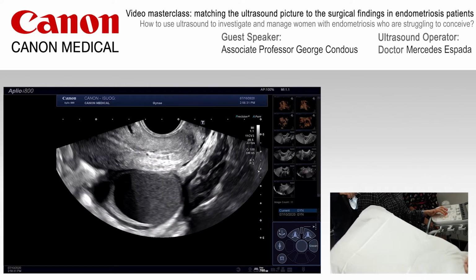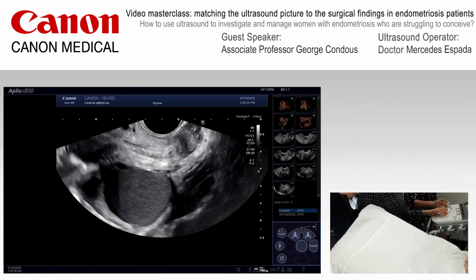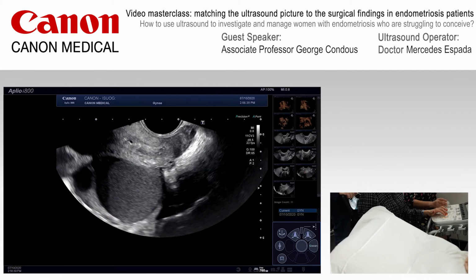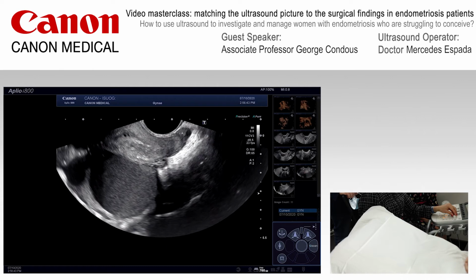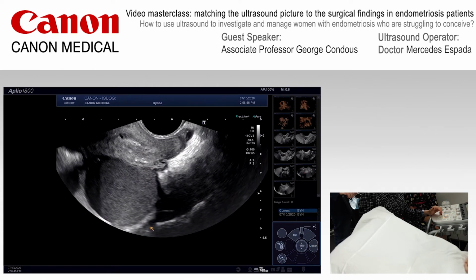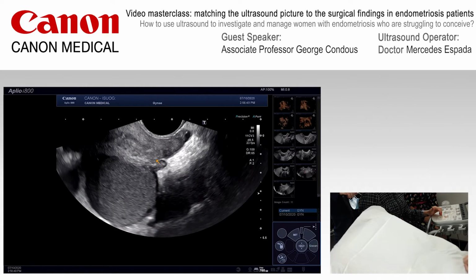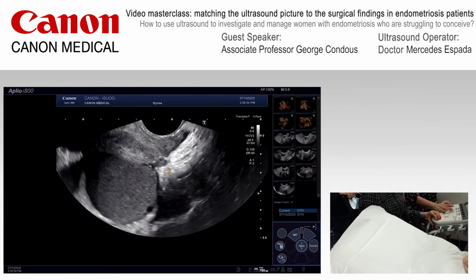What we will do whilst we're in position there, so you can see the cervix, we can see the endometrioma, I think that's on the left side. As we gently press that probe up against the cervix, and if we maybe zoom out just a little bit, and press that probe against the cervix, you can see quite clearly that although there's movement within the bowel contents itself, there's no movement between the bowel and the surrounding cervix itself.